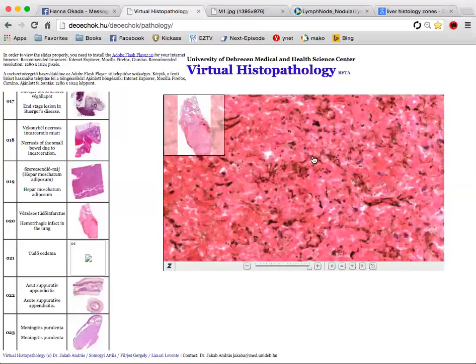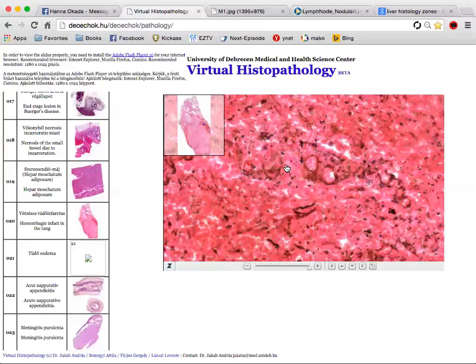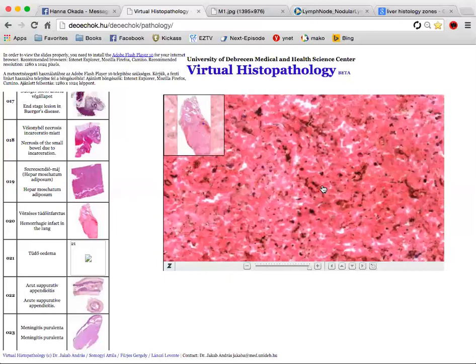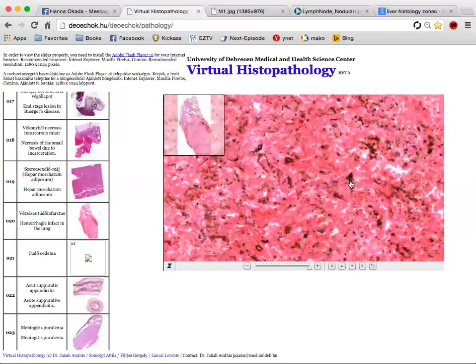But most of the brownish pigment, if it's more brown, then it's partially digested blood. So the darker areas, that's coal. And if you remember from your autopsy, coal is like dust.